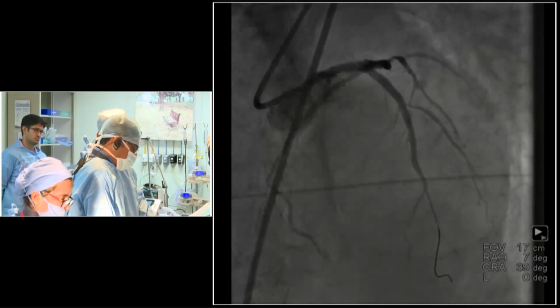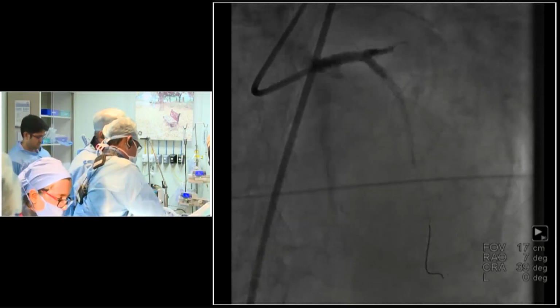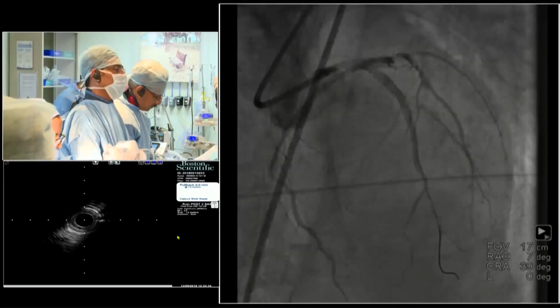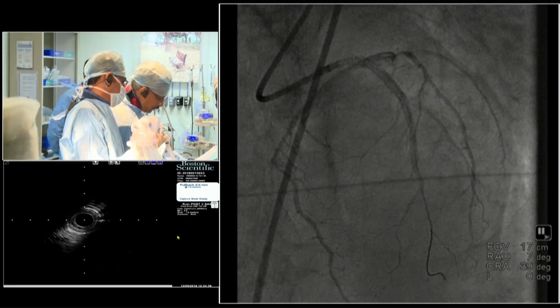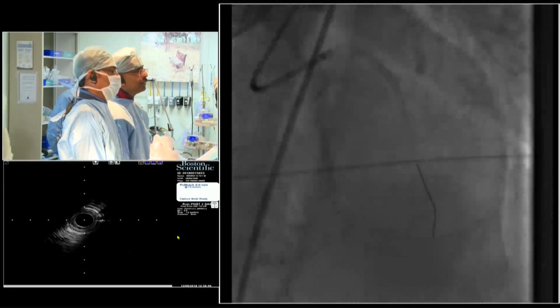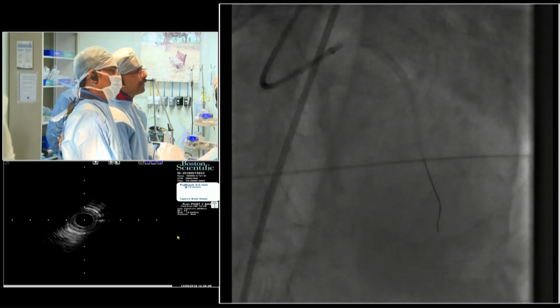Okay, Dr. Ajit and Dr. Vijay, we'll have a minute to see the left main part of the IVUS. Can we take 2 minutes more? Okay, they will have to take 2 minutes. IVUS is almost in. So if you give me 1 more minute, we'll give you the IVUS. Okay, fine. We'll do a manual pullback. I'll just give you a quick pullback in a minute.